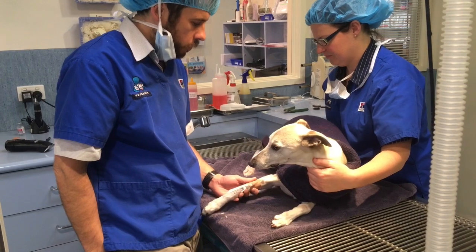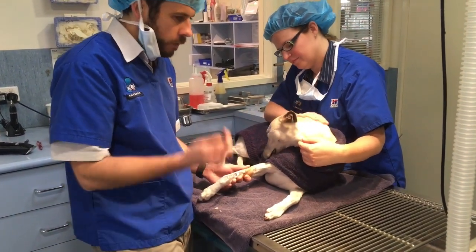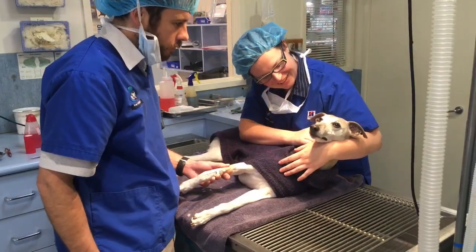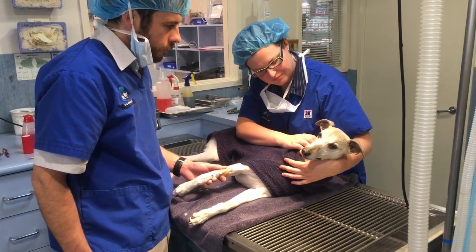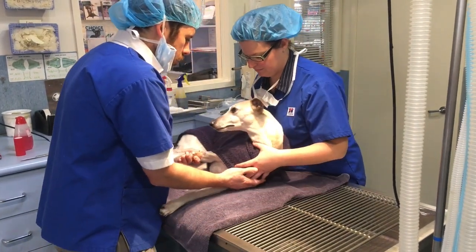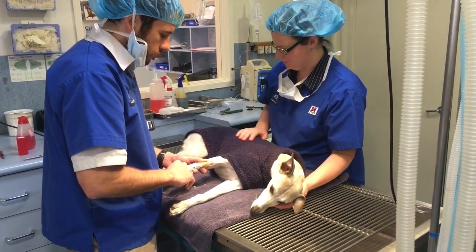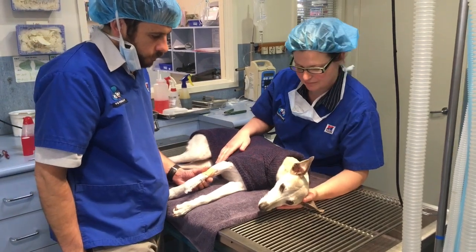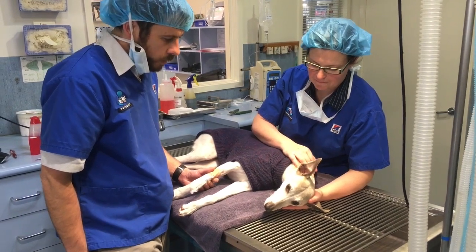We just give it a little bit more to effect. We're trying to get it to the point where we can pass a tube down into the airway that's then going to deliver the anaesthetic gas. I'll give that another few seconds and see if she's going to be deep enough so we can intubate her.